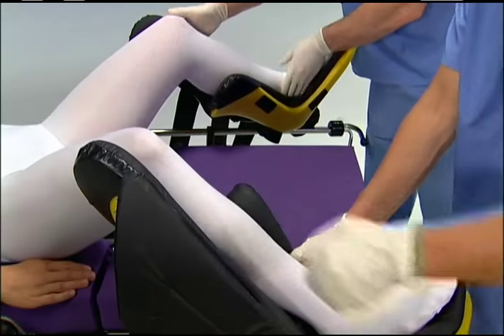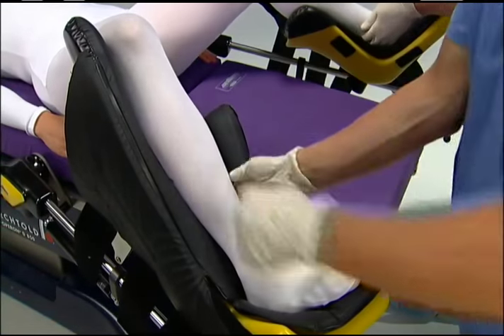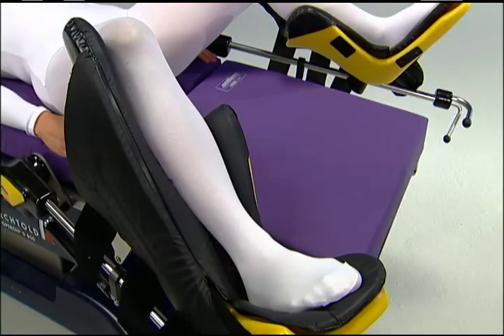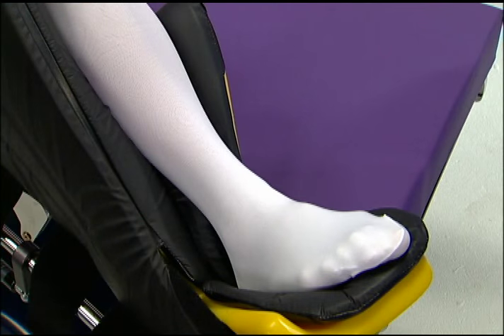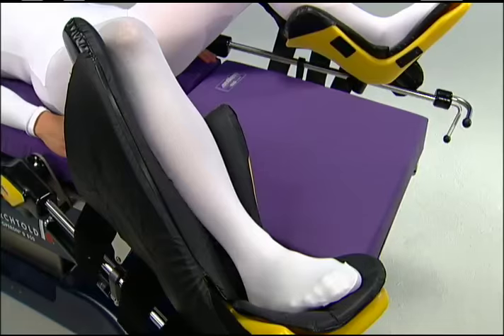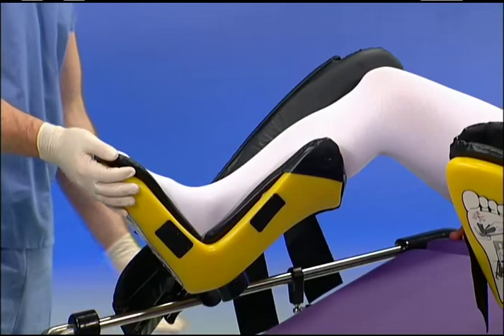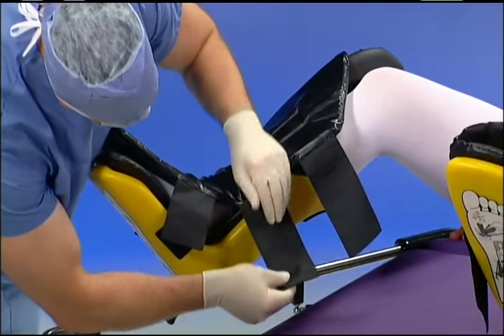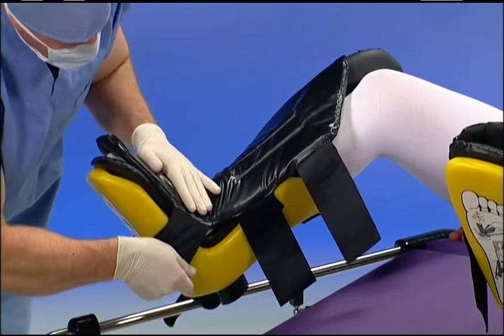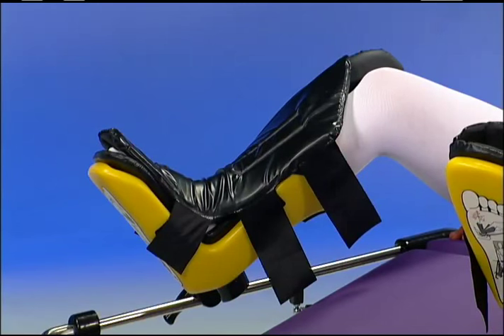When placing the leg into the stirrups, make sure one hand goes under the patient's knee while the other pushes the heel in order to transfer the patient's leg into the stirrup boot. Make certain the patient's heel is seated in the heel cup of the boot prior to closing the boot pad. Note how the floating boot design automatically adjusts to conform to the patient's leg, eliminating unwanted pressure on the calf. The top pad and straps are sewn together to prevent loss. Fold the pad over the leg and attach the middle strap first, then proceed with the remaining straps. The exclusive clamshell pad completely encapsulates the foot, ankle and lower leg for comfortable, secure positioning, even in radical elevated lithotomy.